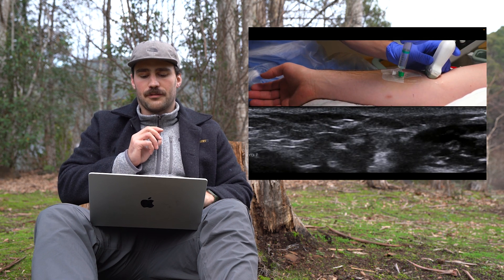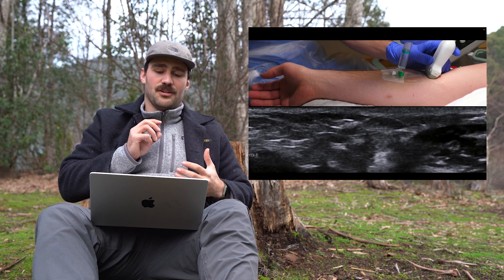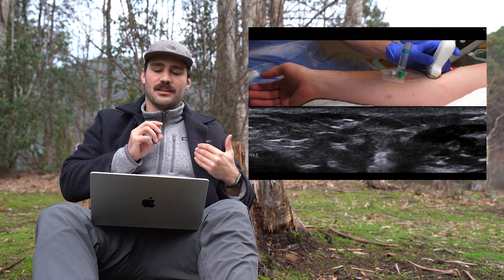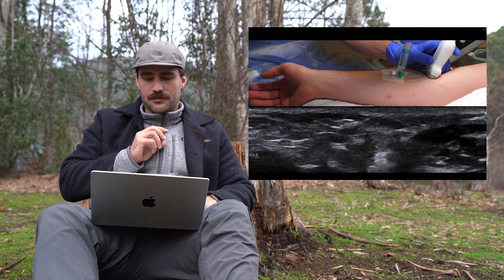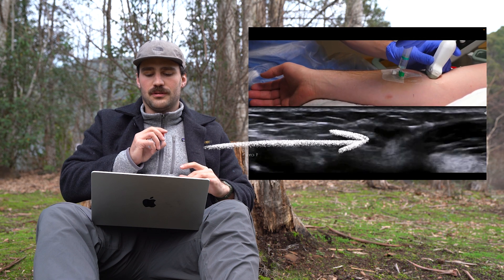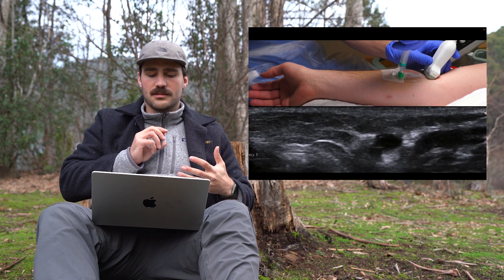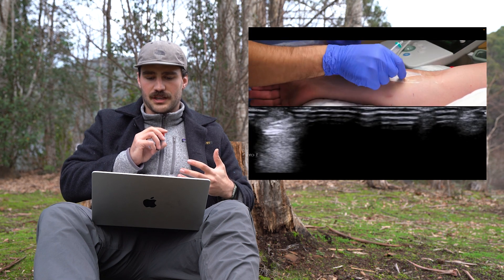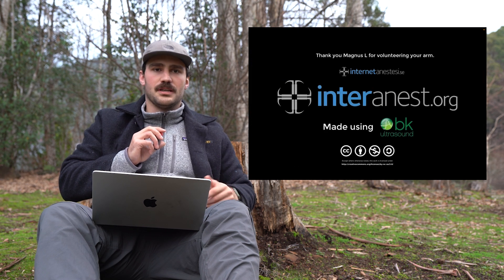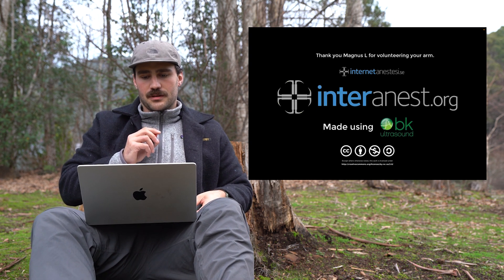They're going back with the ultrasound to check the fluid. When they push the fluid in, they want to make sure it's going into the vein — that the cannula is working. So they push the fluid in, and as you can see it fills up that black circle. Now it's more cloudy and white on the ultrasound, which is essentially just the fluid that's been inserted — usually normal saline, which is just salty water, as I tell patients.